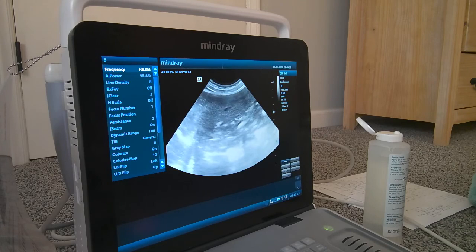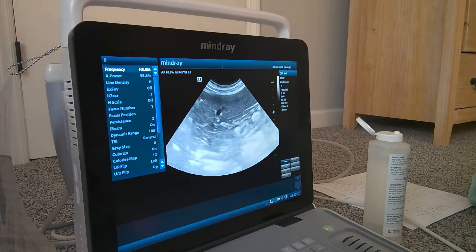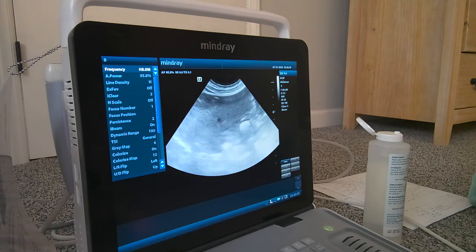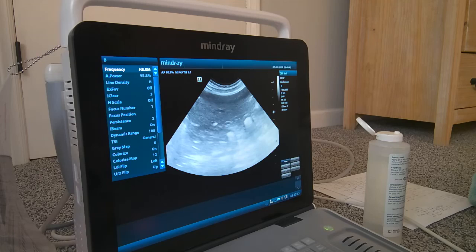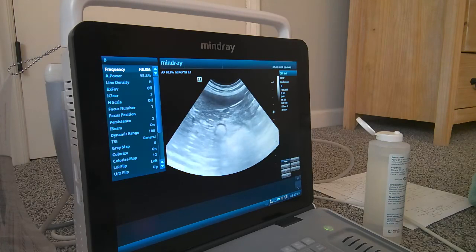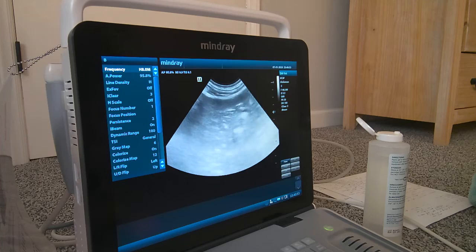If there was thrombosis, sometimes you'll see that hyperechoic thrombus in the vessel itself. And then we're going to look for hypoechoic regions of the spleen where they're not getting perfused anymore. So again, I've got the sagittal view. I'm going to go all the way in every plane, come back medially, go all the way laterally. When you're doing this, don't forget to get the head of the spleen.